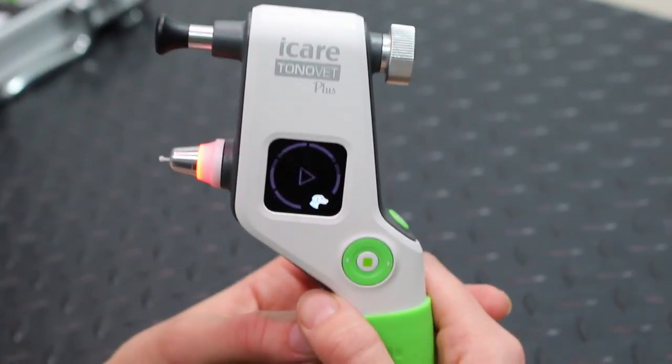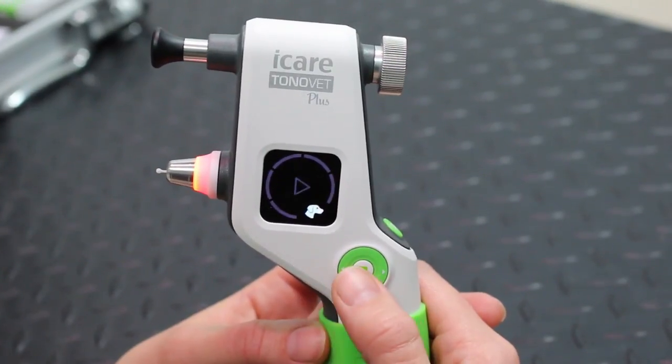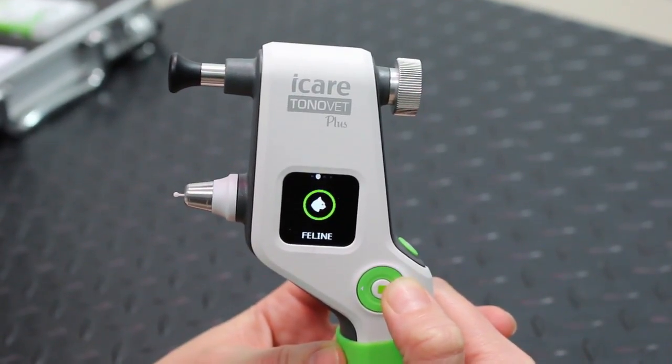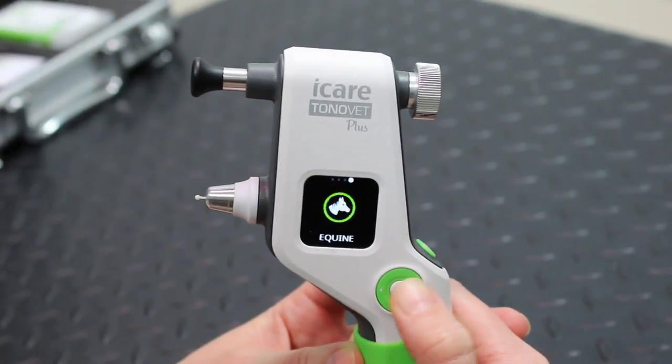When the iCare TonoVet Plus is first turned on, it comes up with the species that it's currently on. To change between species, it's simply a case of scrolling through the menu: Canine, Feline, Lapine, and Equine.